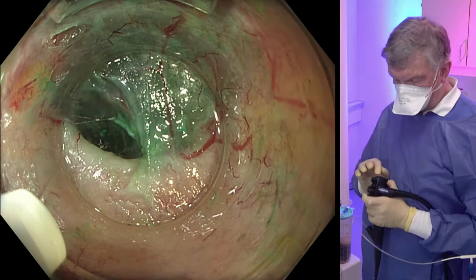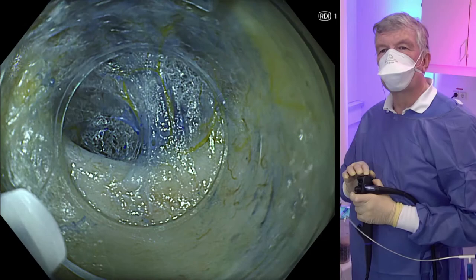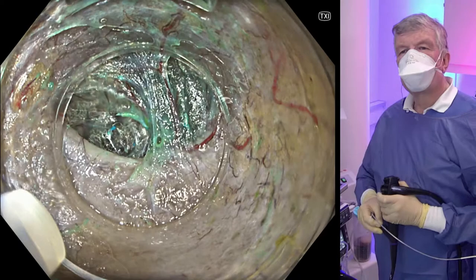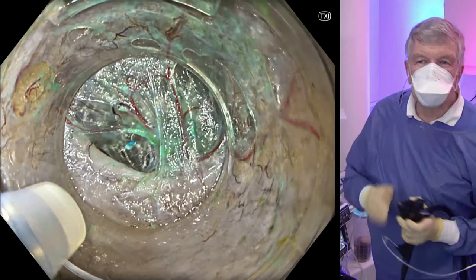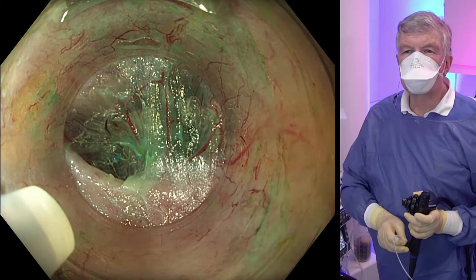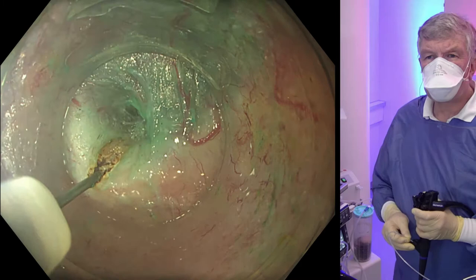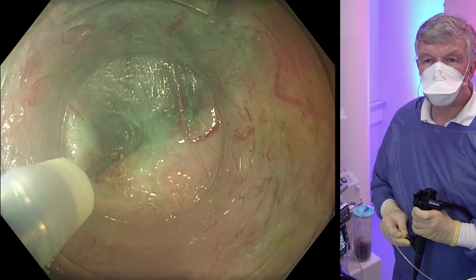We now go back with a knife in place. Here we look at RDI again to visualize the submucosal vessels. And this is TXI — an enhancement of texture, color, and brightness — which might be a new form of white light. Now we exit the knife and start slowly cutting the pyloric muscle, starting the myotomy, very cautiously, step by step, layer by layer.